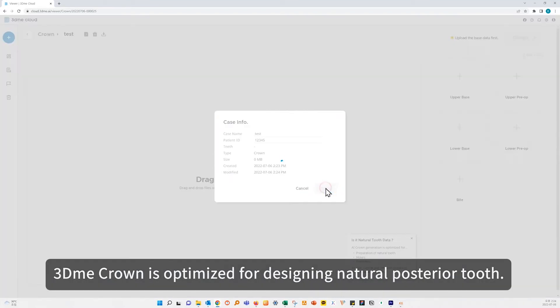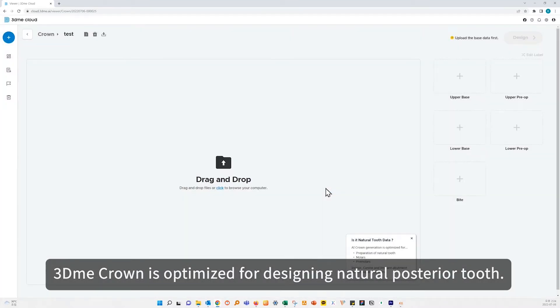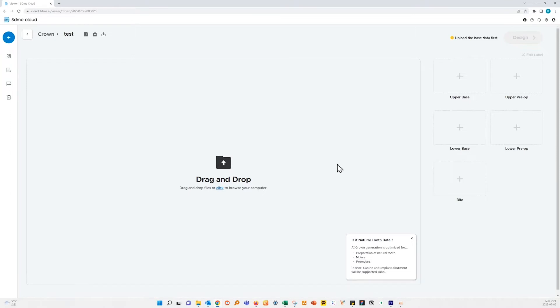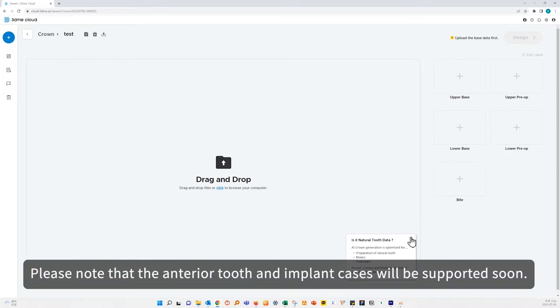3Dme Crown is optimized for designing natural posterior tooth. Please note that the anterior tooth and implant cases will be supported soon.